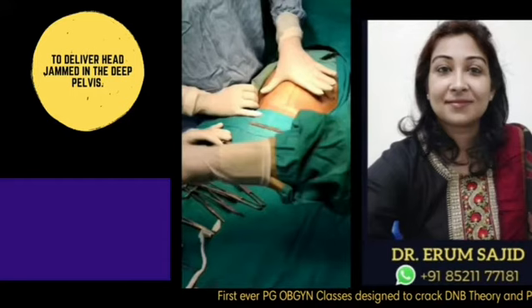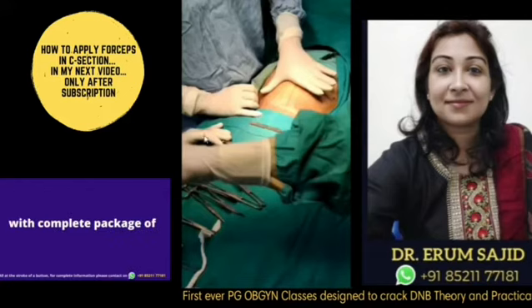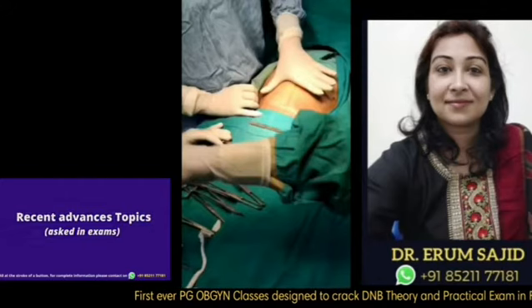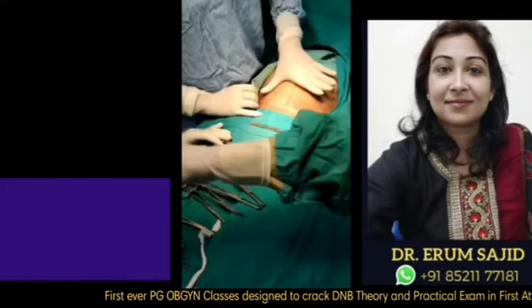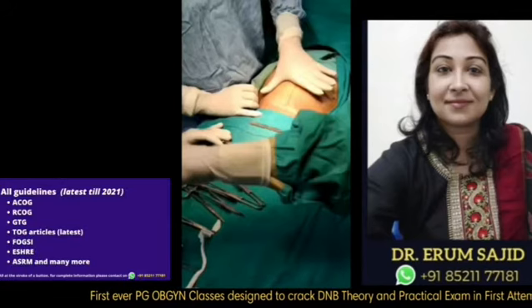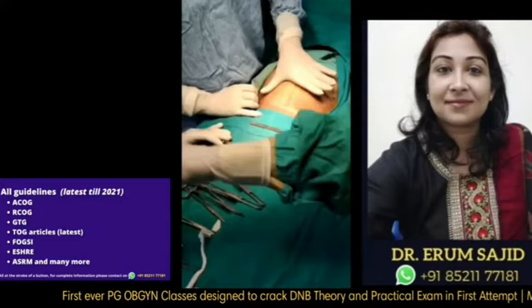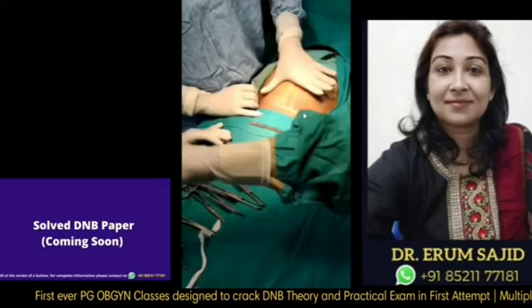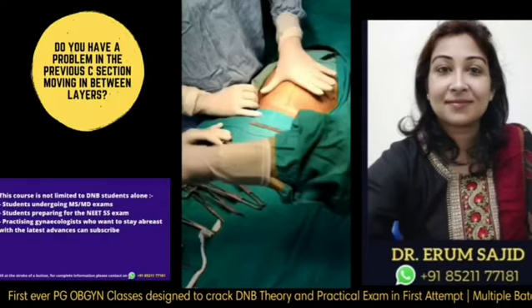The previous C-section which I showed you was on a vertical incision on the skin. So every problem that you can face with a vertical skin incision was told to you in detail: how to enter the abdomen, how to take out the scar, how to give traction, what things to do, what things not to do. This time I'm deliberately showing you a previous transverse skin incision, so that you understand the problems with a transverse skin incision, which you will find more in your practice.